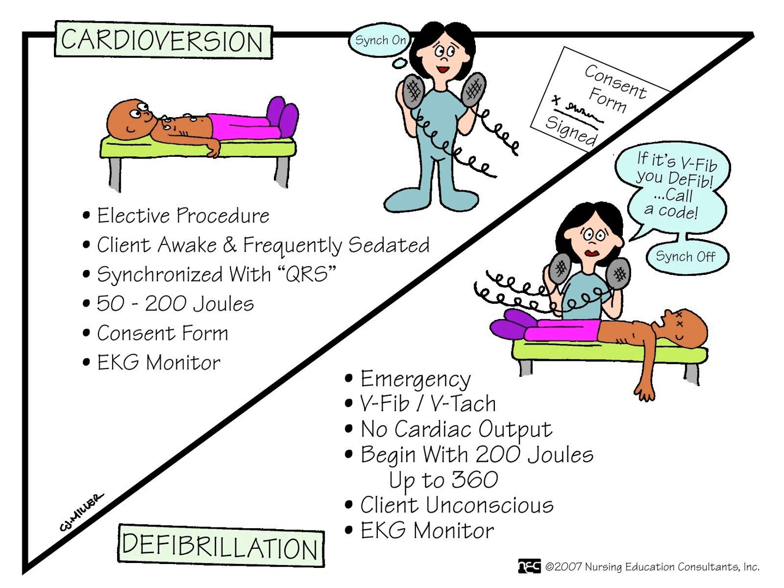Okay. So, for example, if a patient has atrial flutter, you don't have to memorize this, but I'm just telling you that the treatment and the amount of joules is going to depend on the patient's dysrhythmia and level of hemodynamic compromise. Okay, for atrial flutter, they may select even 25 joules. Okay, this slide says 50 to 200, but they could select even 25. For atrial fibrillation, if they want to convert that one, they're going to use 100 joules.